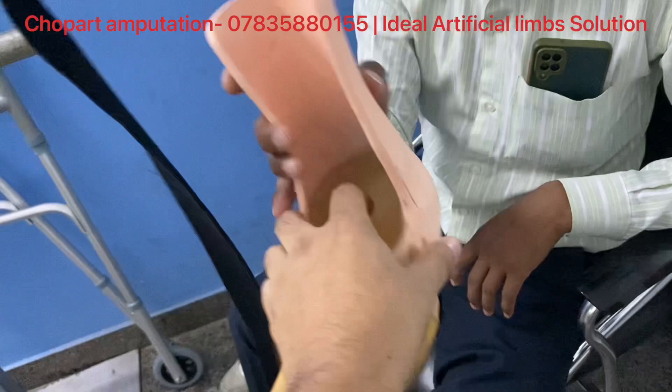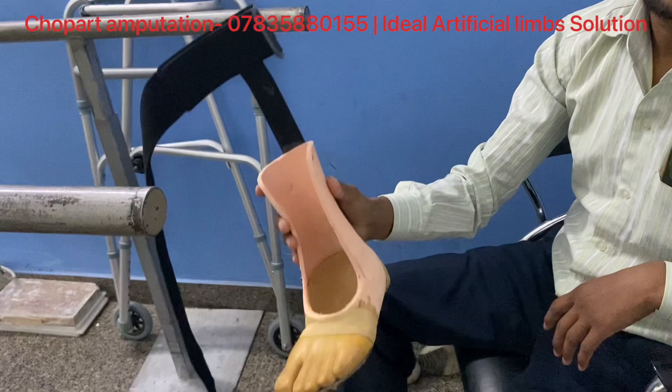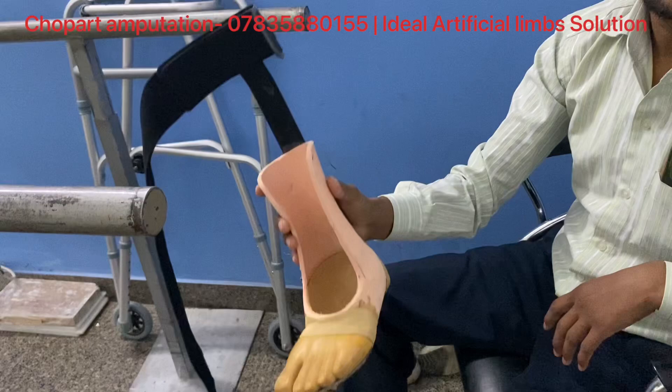How much light weight is it? 50 grams. There is a weight in it — it is 80 grams. Are you satisfied? Yes.